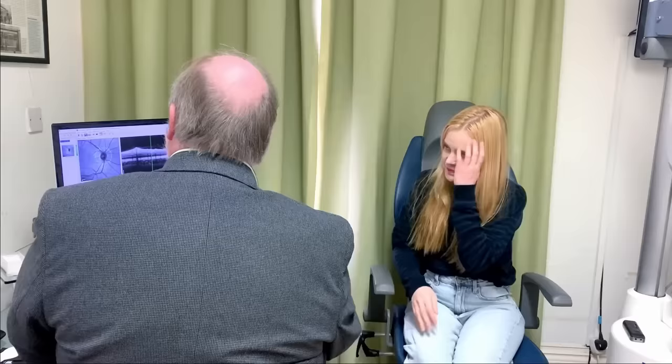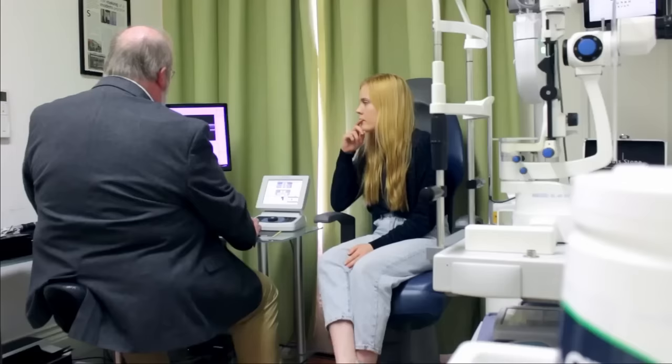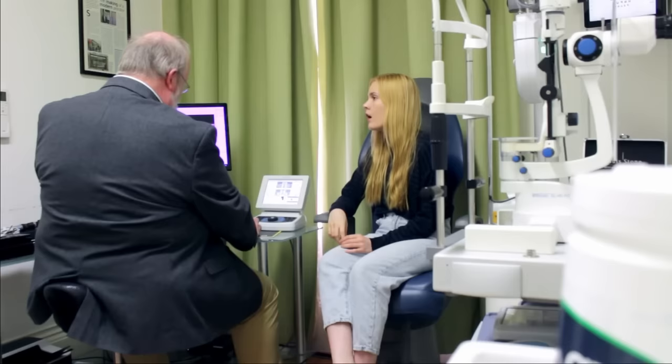So these are all your nerve fibres, about 1.5 million nerve fibres that go down your optic nerve, so it's a fair few, isn't it? And we look at these, and we look at the optic nerve to see how healthy your vision is, but also how healthy you are as well. So there are certain issues that can be seen on that, and you're also perfectly healthy.